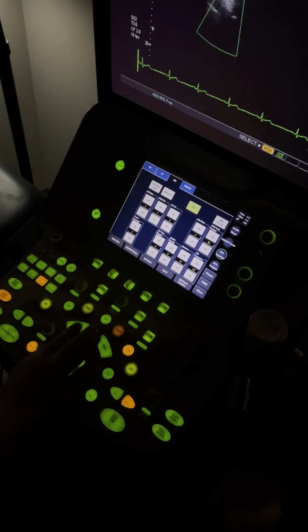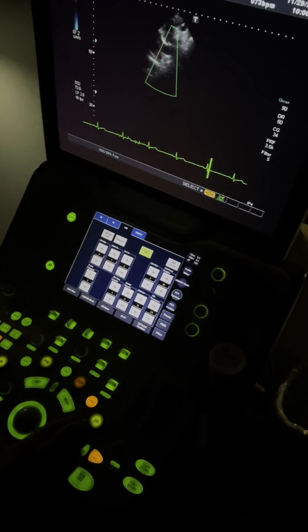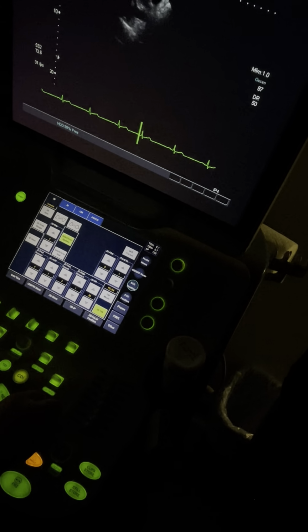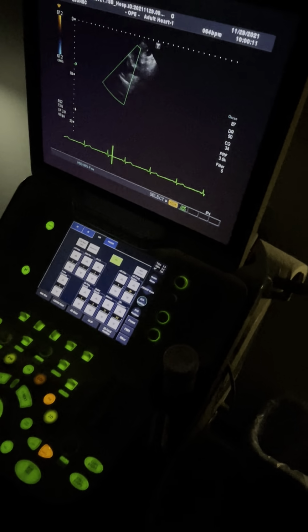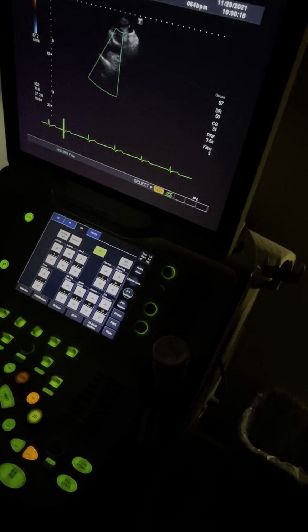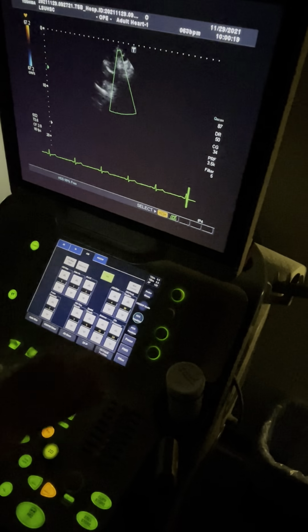Okay, so sometimes I use color to cheat. I'm looking, there it is. All right. This is the transverse right here. So ascending's gonna come up here. Transverse is like the arch. Yeah, so the ascending, transverse, descending.